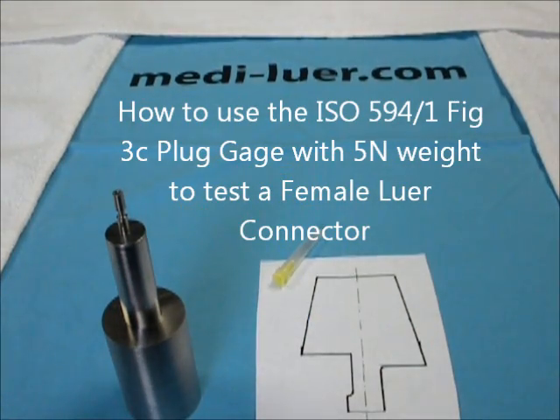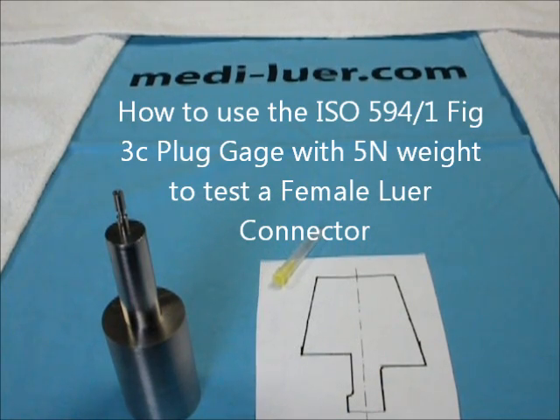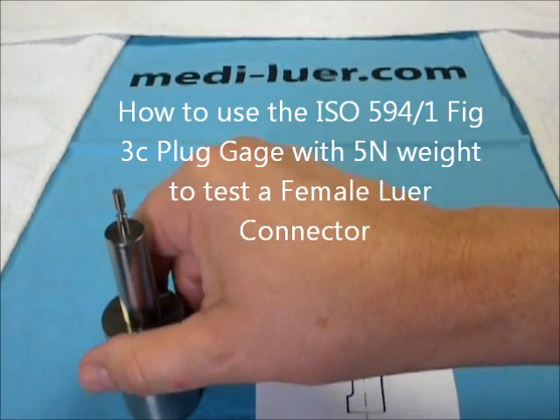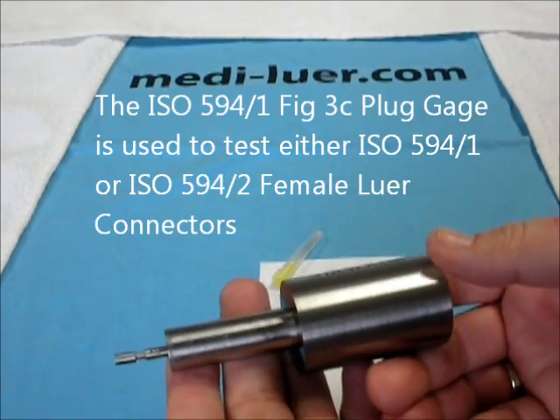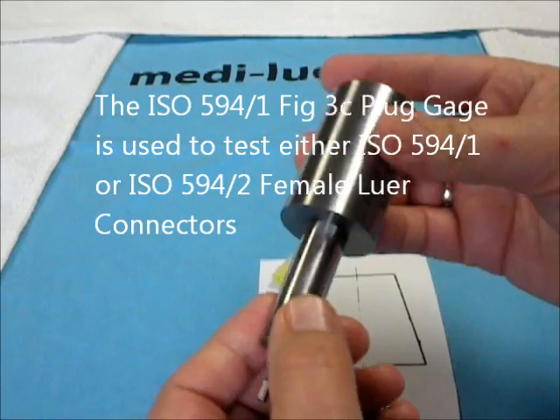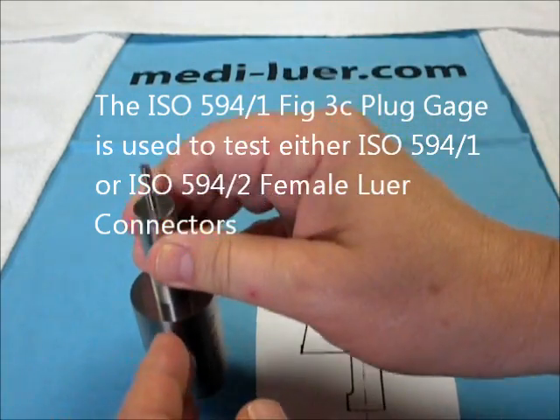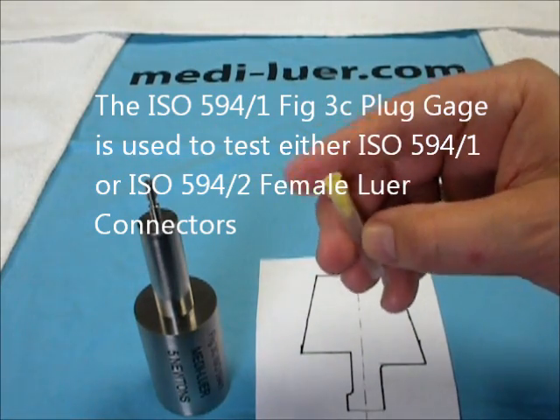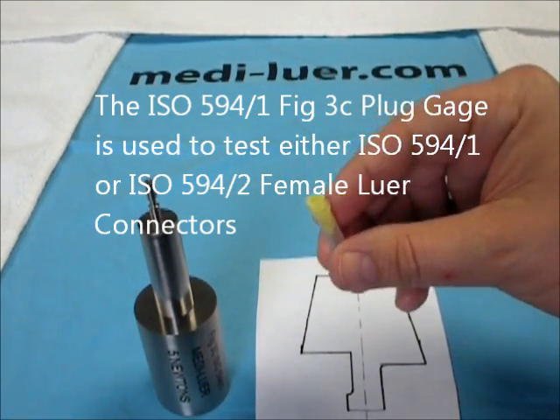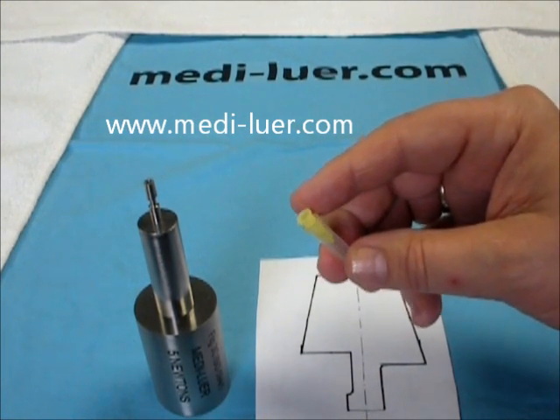This is a demonstration on the use of the ISO 594-1 figure 3C plug gauge. This gauge can be used on either an ISO 594-1 or an ISO 594-2 female lure connector. In this case, I have a needle made to ISO 594-2.